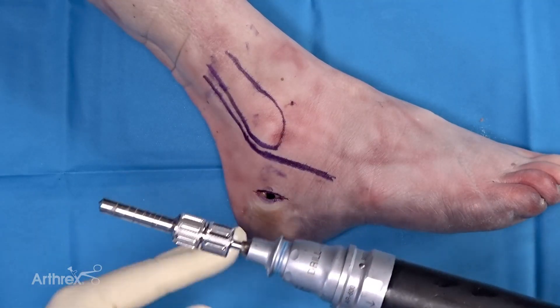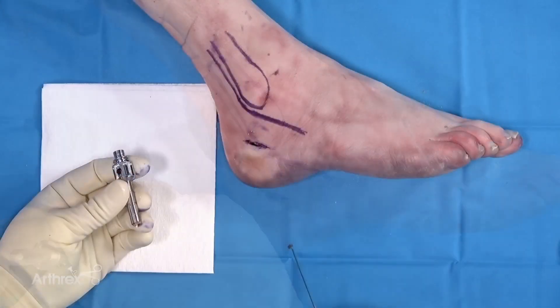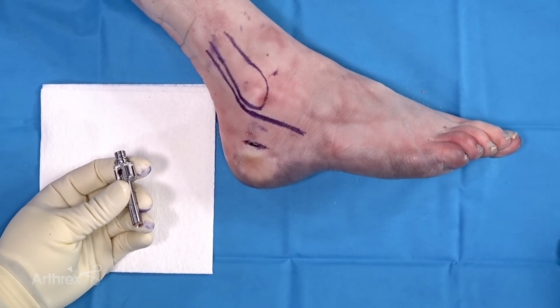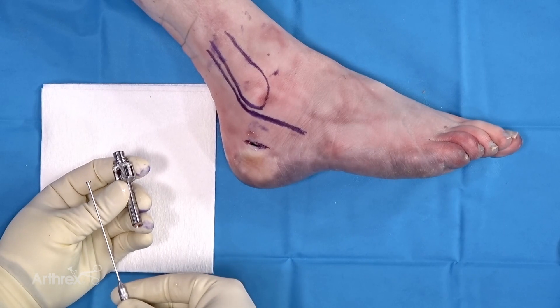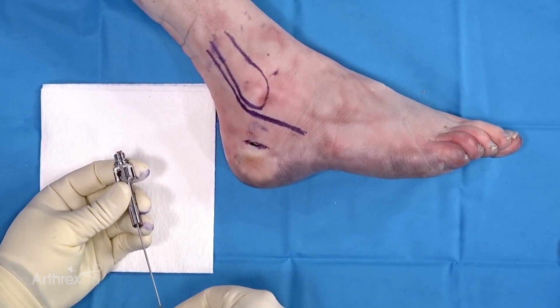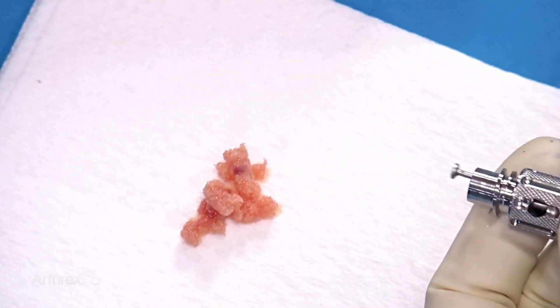Still on forward, we pull our harvester out. We can disconnect. Once we've obtained our graft and removed it from the quick connect, we can use the plunger to extract the graft from the harvester. That slides in and we use the plunger to extract that nicely morselized graft.